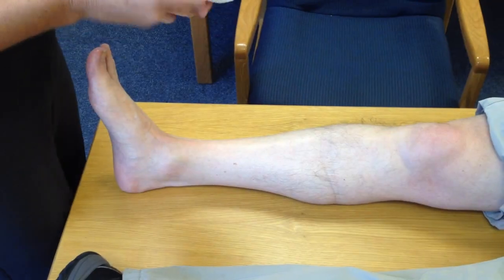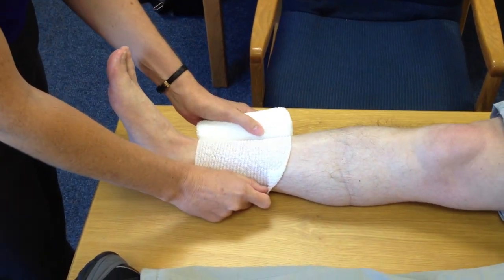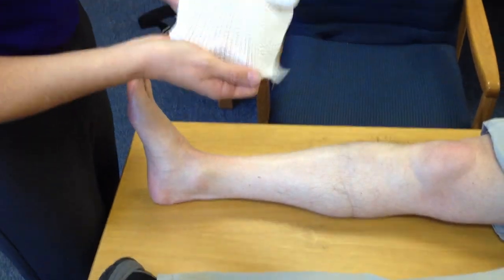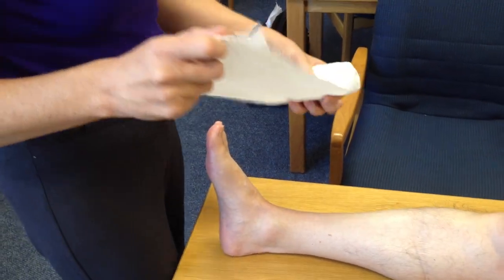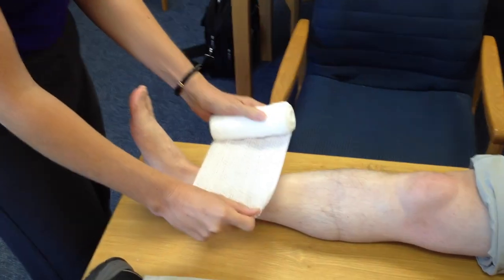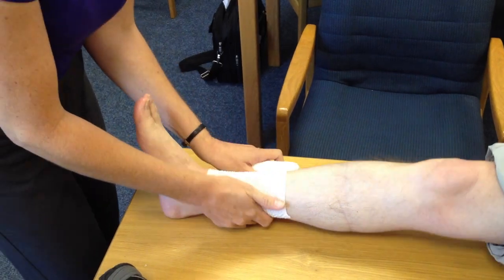For practicality reasons, this system is started at the ankle. Because a lot of patients that need to be in this system come from the developing world and do a lot of walking. So if the system starts higher up, it tends to fray from the edge out and the sustainability of the bandage is lost. So it is started the same as in short stretch theory — at the ankle.